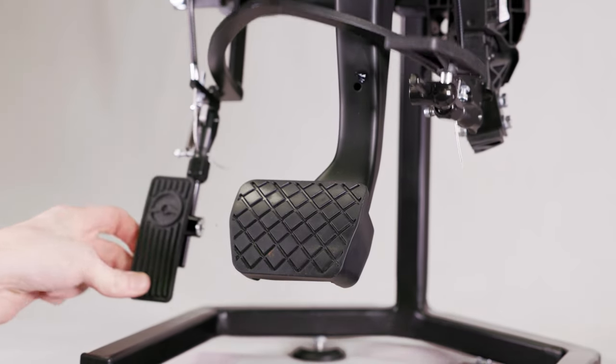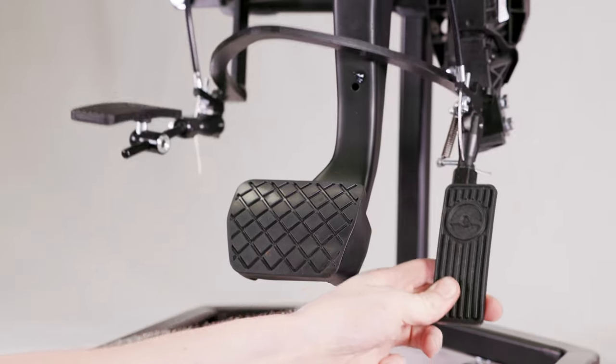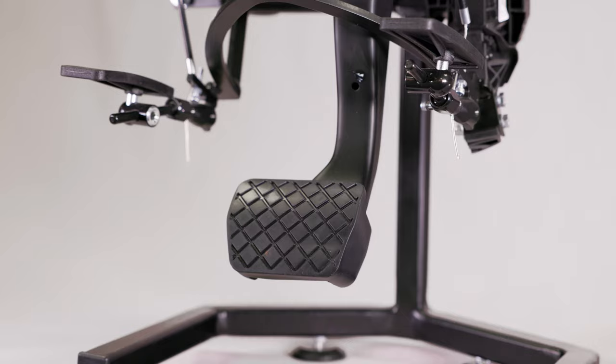Your individual needs and vehicle will determine which type of left foot accelerator will be ideal for you, but all designs mimic the original pedal for ease of use.